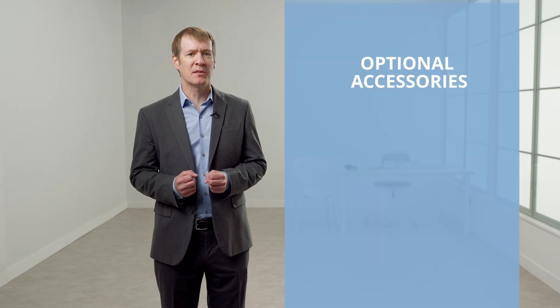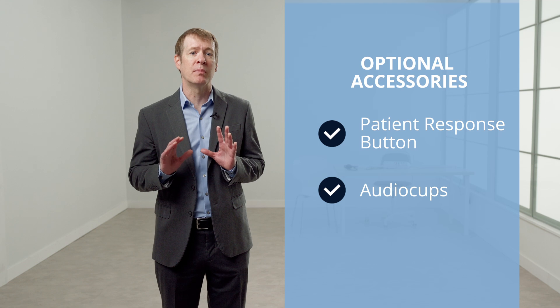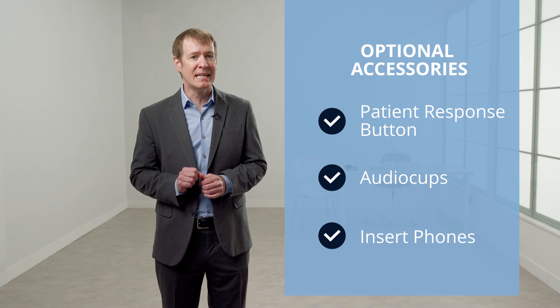Optional items include a patient response button and audio cups, which are circumaural enclosures that fit over the headphones to block out noise. Insert earphones are also available with the GSI 18 and can be added in addition to the headphones. The GSI 18 contains the calibration for both types of transducers for easy transition between styles.